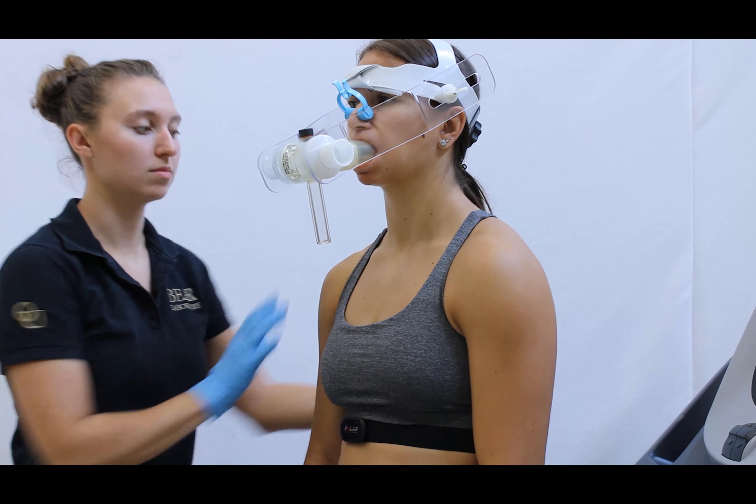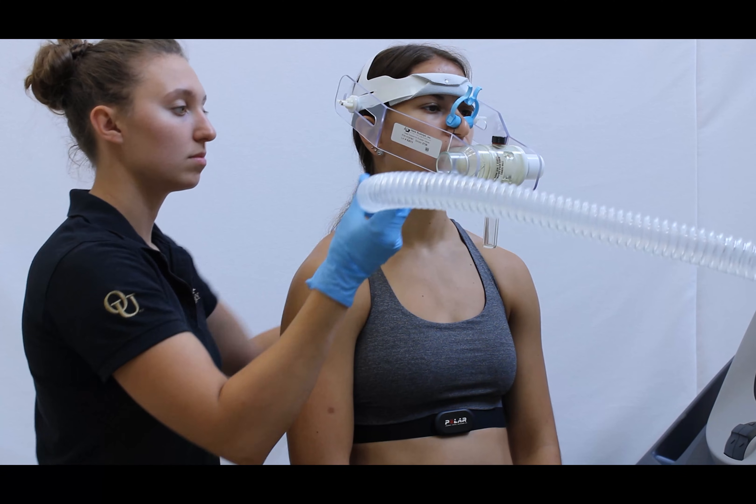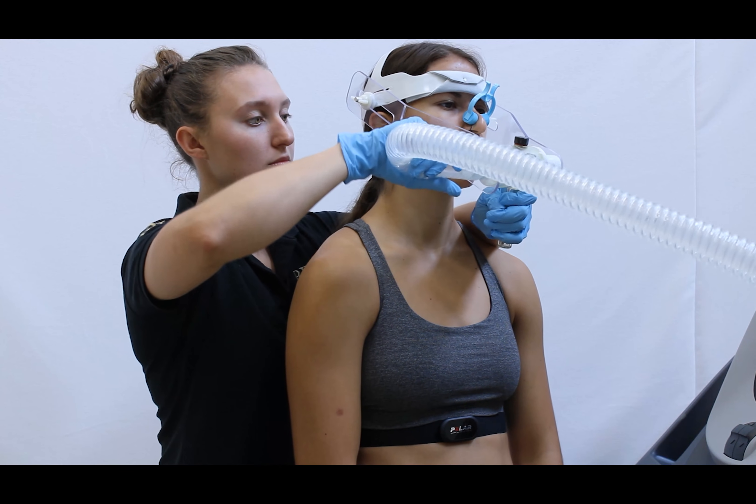Have them wear the nosepiece. Attach the tube from the cart to the right side of the mouthpiece, which is connected to the participant.